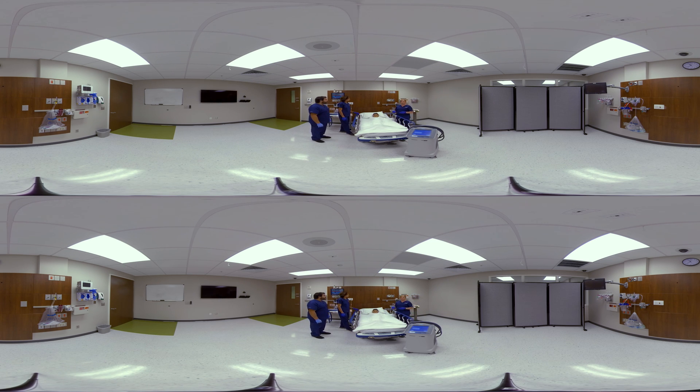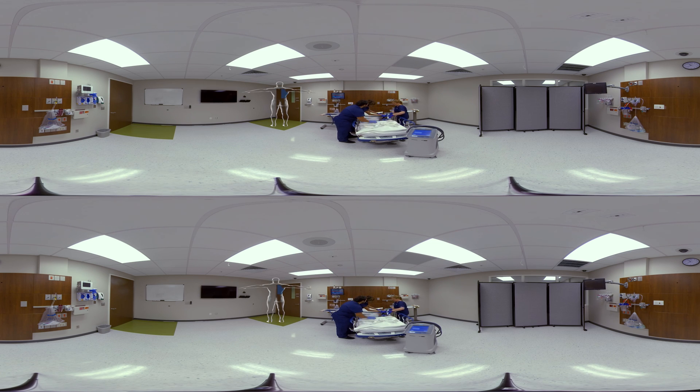We're going to locate the pads with the long straight edge — these are the pads that will line up next to Cruz's spine. Melissa is going to peel off the outer layer to expose the gel and line the long straight edge up next to his spine, making sure it's not on top of the spine. We leave about a finger width distance there. When we roll him back over, it's going to wrap just across his abdomen.